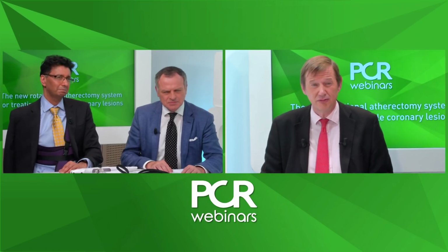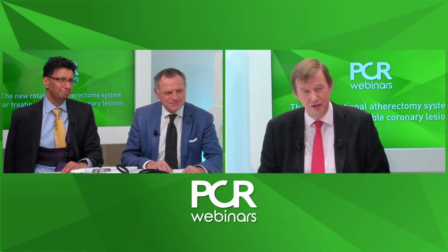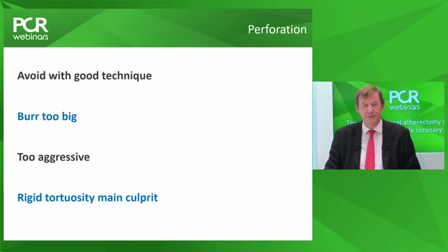So the stuck burr: poor technique, we think, aggressive pushing, perhaps tortuosity does increase the risk. Stopping the burr in the lesion is a big no-no, and sometimes you've chosen a burr that's too big, and the lesion's just too much for it.